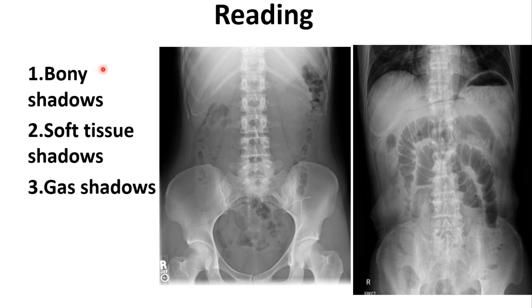Now we discuss the reading of a plain X-ray of the abdomen. The first thing we look for is the bony shadows — the bones visible in the X-ray. The lower ribs are visible; this is the last rib, the 12th rib, then the 11th, 10th, 9th, and so on. After the ribs, identify the vertebrae, and decide the number and type. Since ribs articulate with thoracic vertebrae, the 12th rib articulates with the 12th thoracic vertebra.